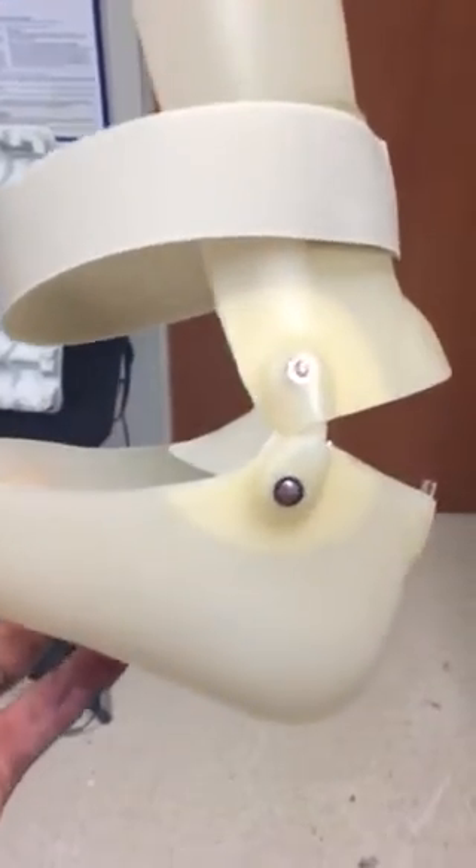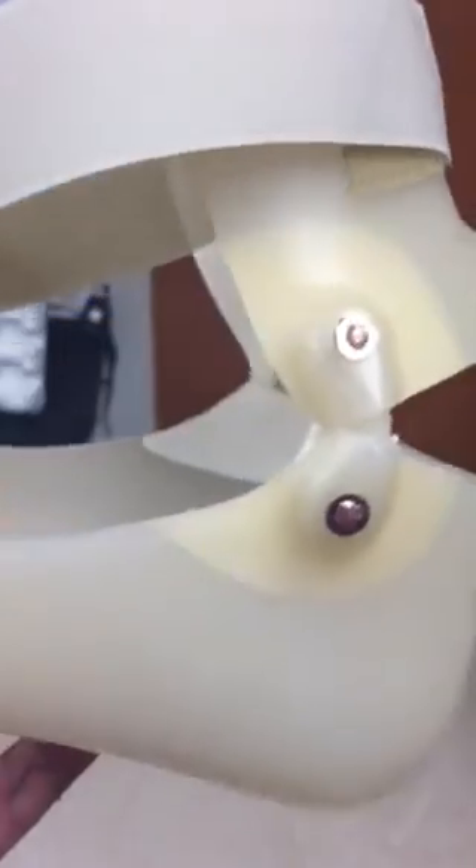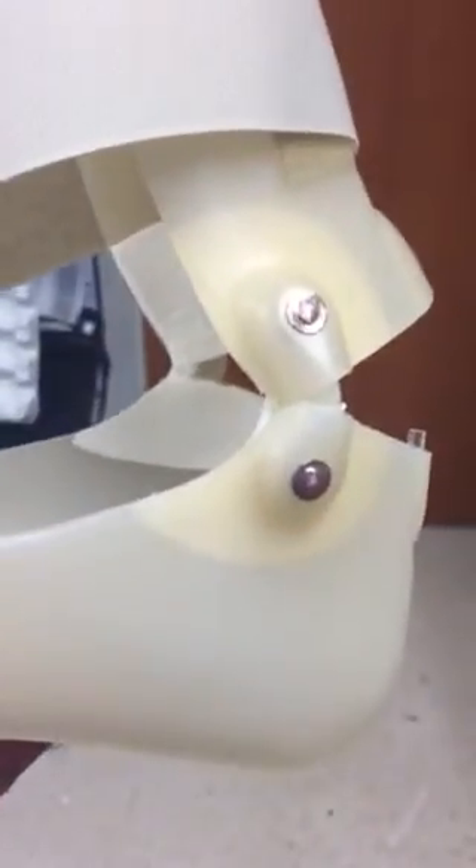And this is just something that we call a dorsiflexion assist joint for an AFO. You have one on each side of the ankle right here as well.